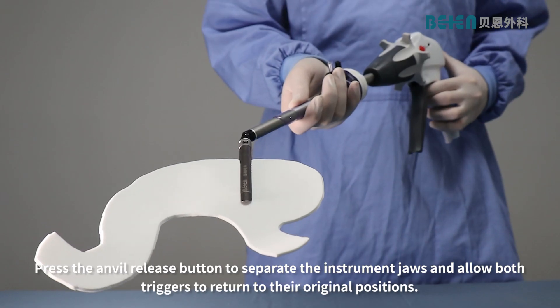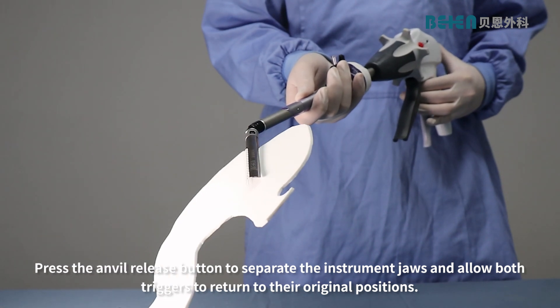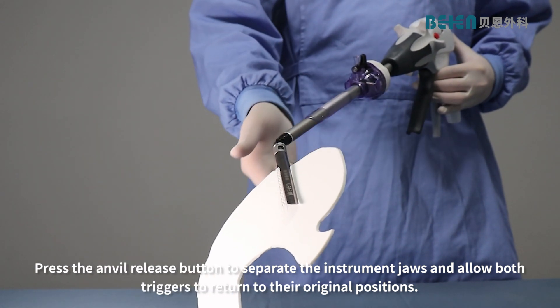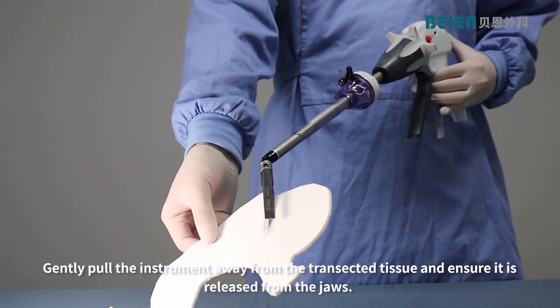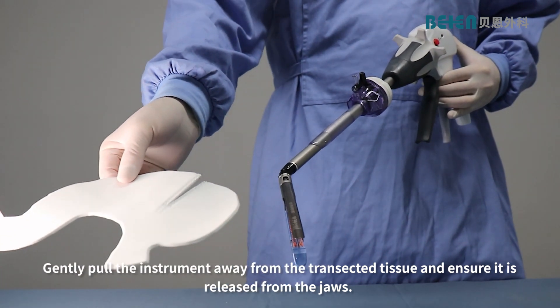Press the anvil release button to separate the instrument jaws and allow both triggers to return to their original positions. Gently pull the instrument away from the transected tissue and ensure it is released from the jaws.